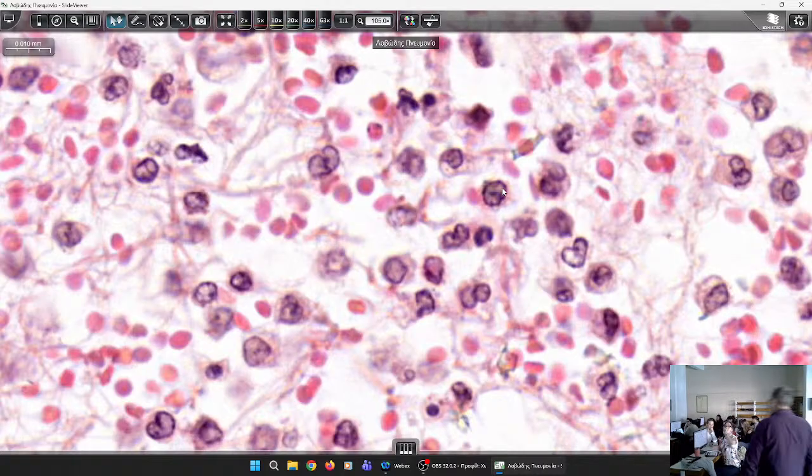Okay, yes, please. Can you just show the macrophage? The macrophage? Is it that? Yes, come and ask me. But take care because the video is on. No, not you, not you.